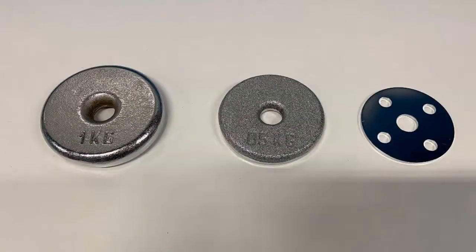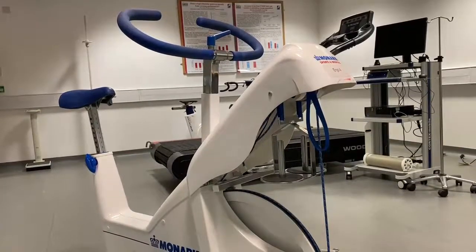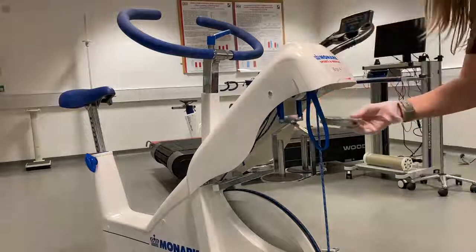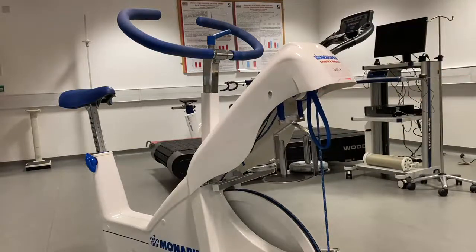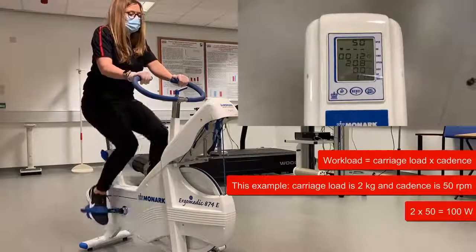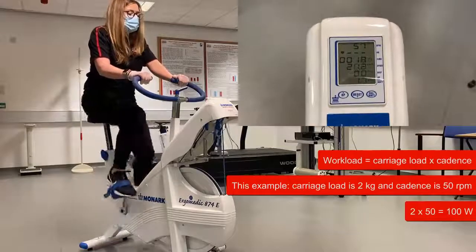To provide different increments there are a series of calibrated weights: 1, 0.5 and 0.1 kilo. During a test, in order to achieve a desired workload, weights can be added to the carriage. For example, one kilo has been added to the carriage which itself weighs one kilo, making two kilos total. Multiplying the load of two kilos by the cadence of 50 rpm equates to a new workload of 100 watts.